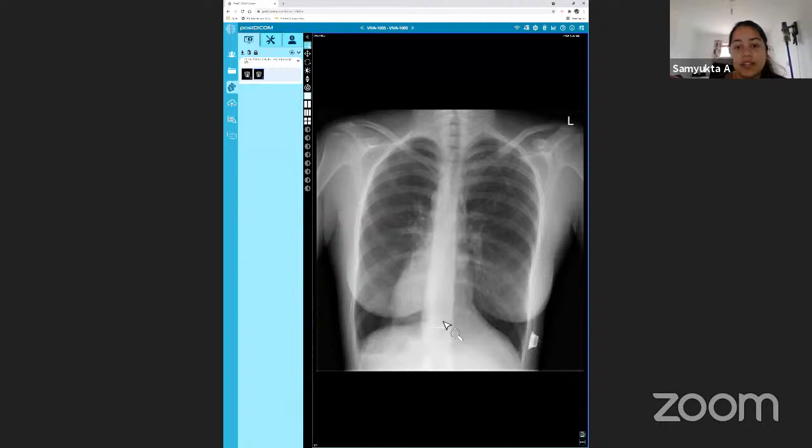And there's increased reticulation in both lower zones of the lungs. And I think it's tubular branching. So I'm suspicious that this patient has underlying bronchiectasis, which would be in keeping with something like Kartagener syndrome, as well as the long-term antibiotics that would probably be delivered through the portacath. So it would correlate with the clinical history.